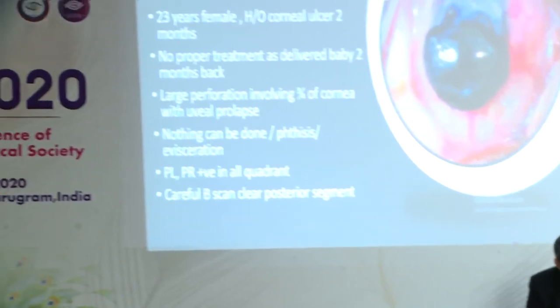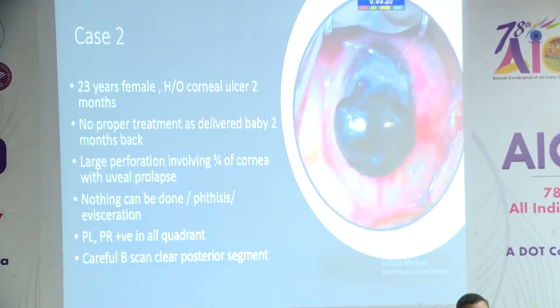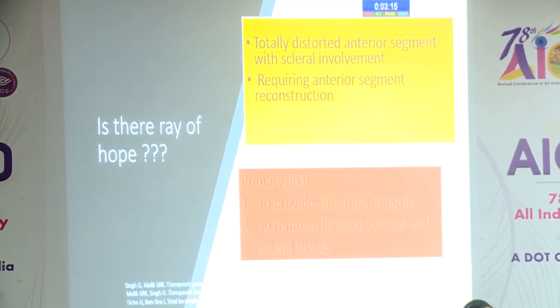This was a total corneal abscess and this was a total corneal perforation. But in both cases, perception of light was present and projection of light rays was accurate in all the quadrants. Patients were advised evisceration. They were explained about the phthisis bulbi eventually. But when we did the B scan, it was clear. So can we give some hope in these cases?